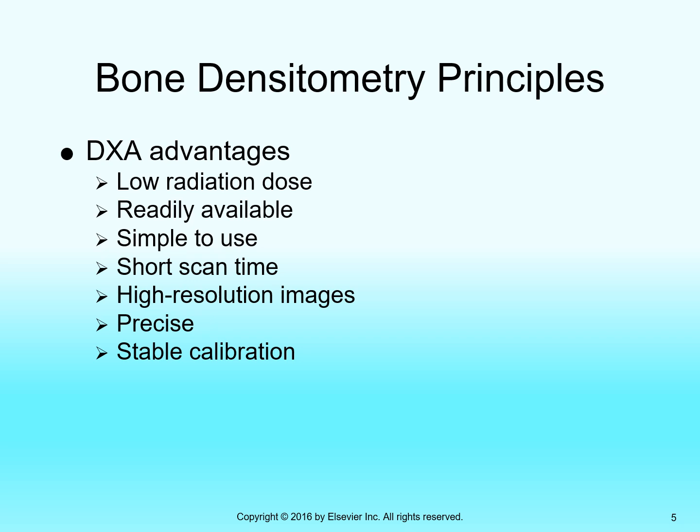Well, a bone densitometry machine has to be precise. That is, if I see 2 patients and they both have roughly the same calcium density, then I should get similar numbers, similar measurements from both scans. That's what precision means. It means repeatable. It means when you run the exam, you get consistent results. Okay? And then stable calibration. It doesn't fall out of calibration as you run the exam, and typically we don't see these things run out of calibration.